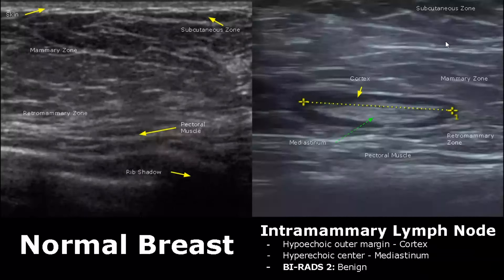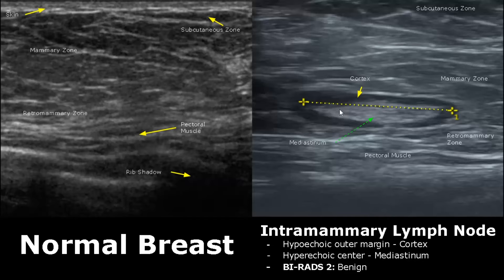Here we have an image of an intramammary lymph node. They have a hypoechoic outer cortex and a hyperechoic central hilum, which is hyperechoic usually due to fat. They are classified as BI-RADS 2.